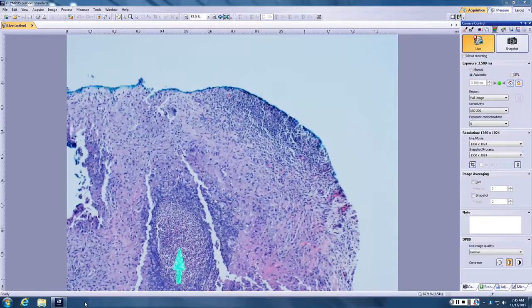So, anyone want to jump in with a differential? So, on the vasculitic side, Wegener's absolutely would be top of your list. Palisaded granulomas, multinucleated giant cells, pus in the middle, Wegener's could look absolutely identical to this. And then, Ashley, you were? Stellate abscess. So sporotrichoid granuloma is palisaded granuloma, neutrophils in the middle.